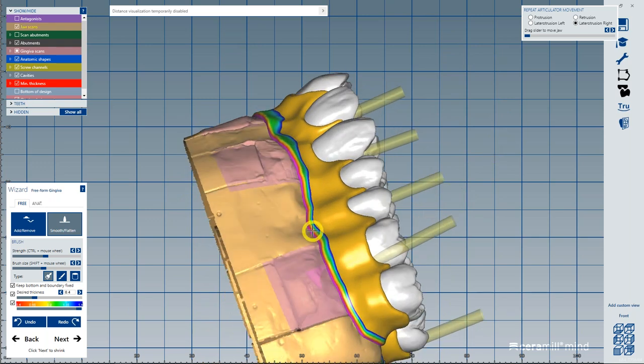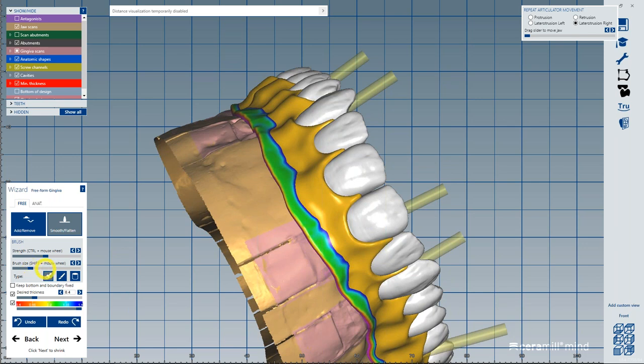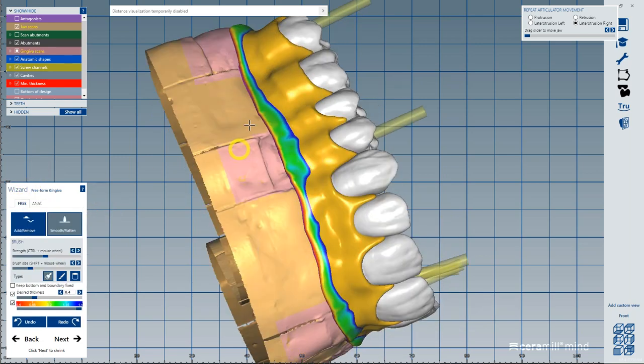Now, if you notice my boundary, I went a little farther here. So right here it says keep boundary fixed. I'm going to uncheck that, and let's bring my brush down a little bit. And I can lift this and paint this exactly where I want. So with our tools, it's just like design tools. Adjusting the gingiva, you have multiple ways to do this. If I wanted to do a huge region and lift this, I can lift it. It just depends on how you guys want to do it. I'll show you both ways.